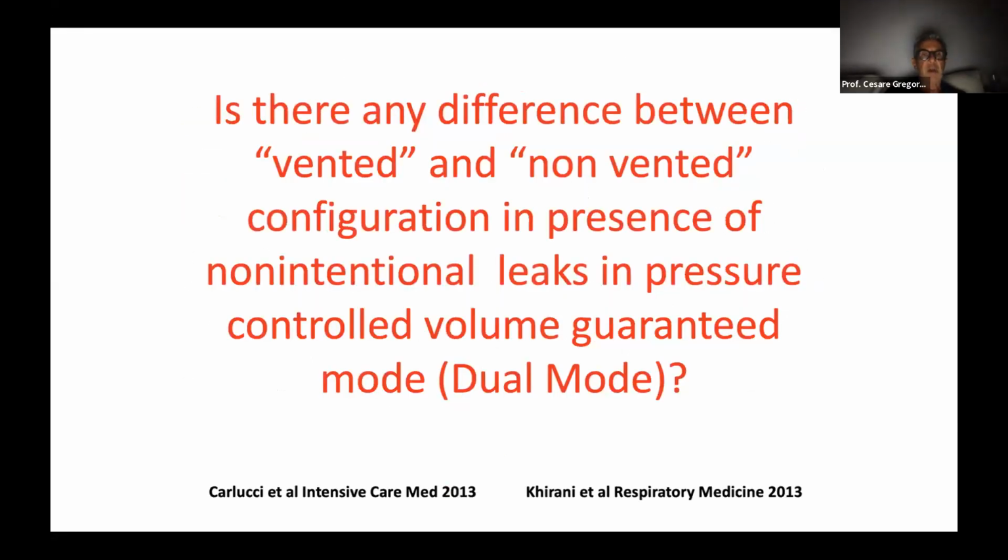Another important issue: even in the United States, dual modes are so common, and we know that some companies provide so-called dual mode, or pressure control, volume regulated. Is there any difference between vented and non-vented configuration?